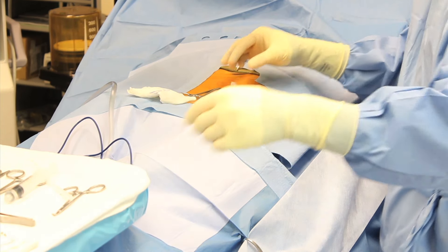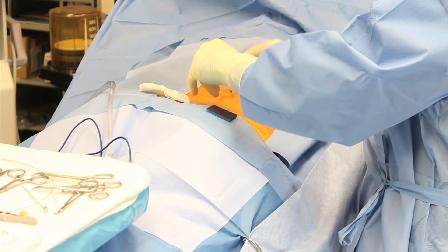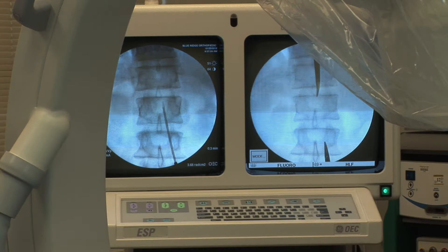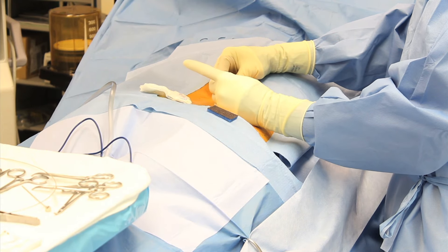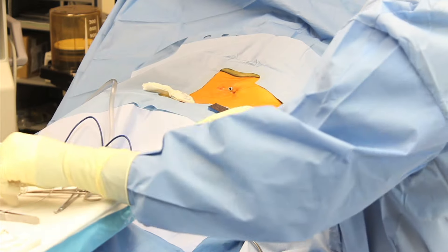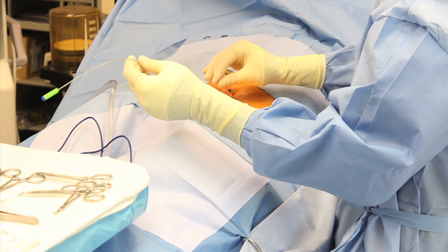Using minimal sedation and liberal skin anesthesia, a glass syringe is attached to the needle. Using the aid of fluoroscopy, which is an x-ray, the physician can feel and guide the needle to the appropriate epidural space, and then the electrode wire can be passed to the previous site of the successful trial using the aid of an x-ray.